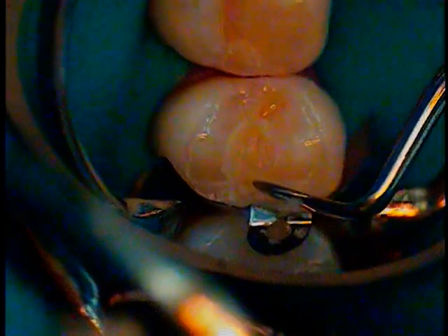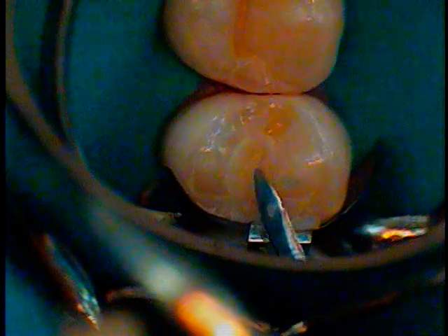Okay, now I'm going to drop some into that distal area, a little bit deficient there. I'm going to push some in there, and come up and push against the lingual wall. Same instrument, Hollenbeck. Okay. Central wall. Explorer next.